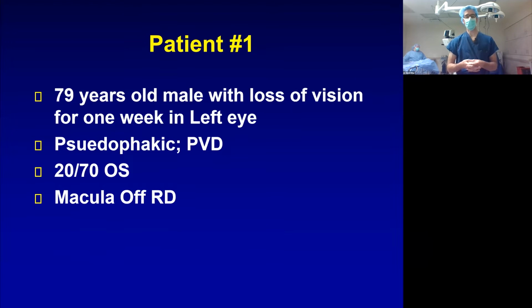So here's our first case. Patient number 1 is on the table here. We already blocked his eye before the case. He's a 79-year-old gentleman who lost vision for 1 week in the left eye, pseudophakic with a vitreous separation. That's a plus for us here. The vision's 20/70, and the macula is off.